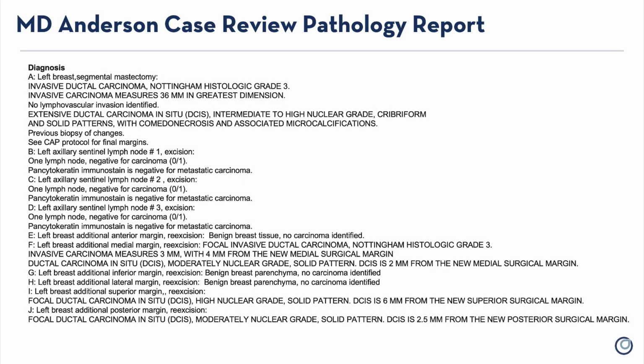So here is the final pathology report. The patient had invasive ductal cancer with surrounding extensive DCIS, which was evident from the OCT images that were reviewed. And again, like I mentioned at the beginning, this surgeon actually took shave margins all around the specimen. So what we could see here is even at the medial margin, the additional margin taken showed still some evidence of invasive cancer and DCIS. So having seen that on the primary specimen, we can correlate that now with the final pathology here and show that that would have been an indication to have taken more margin.